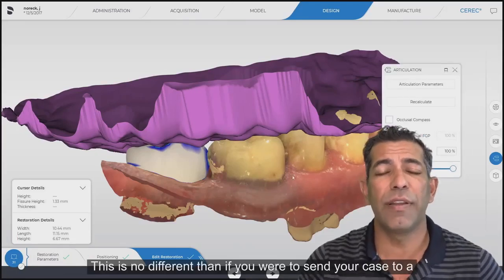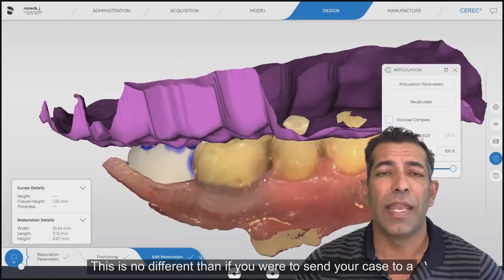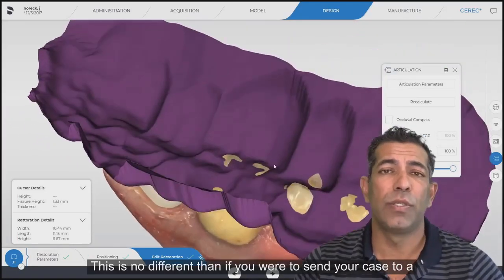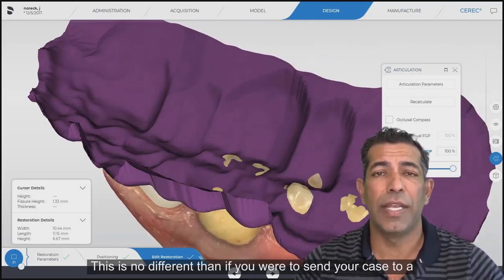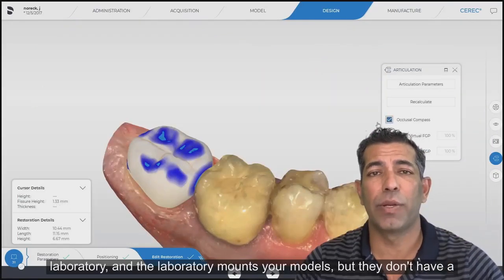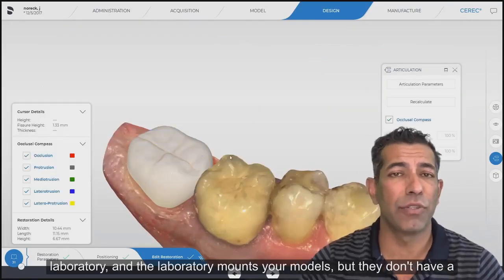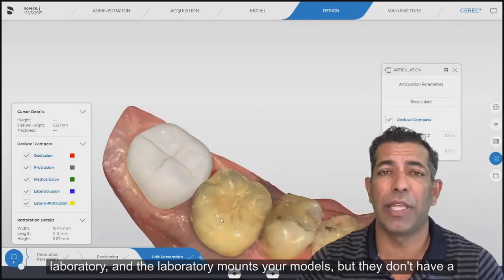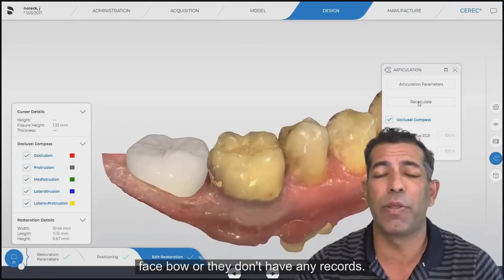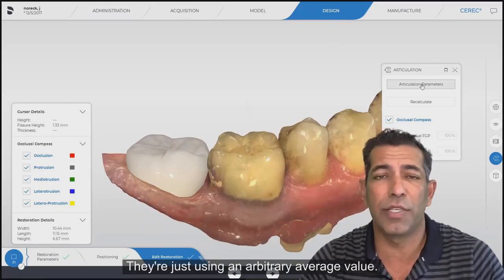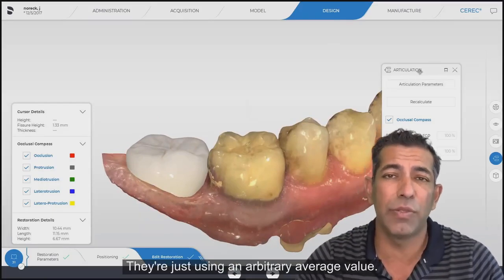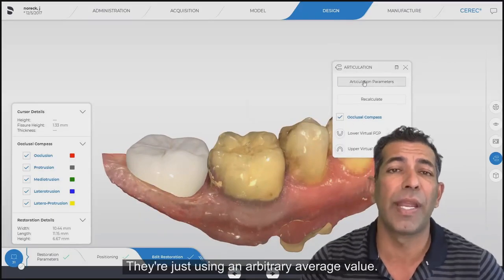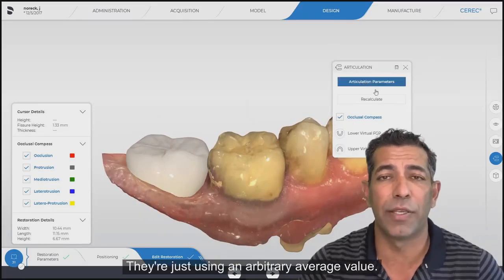This is no different than if you were to send your case to a laboratory and the laboratory mounts your models, but they don't have a face bow, they don't have any records — they're just using an arbitrary average value.